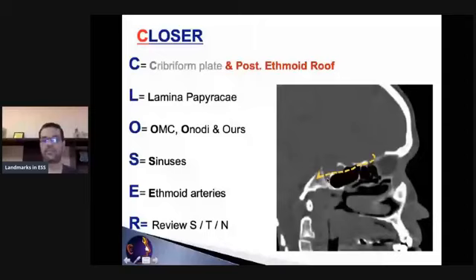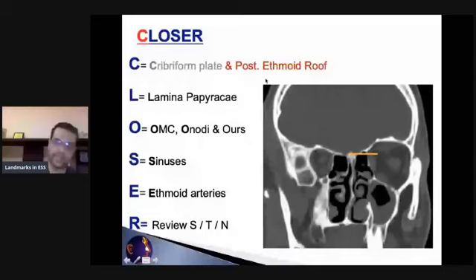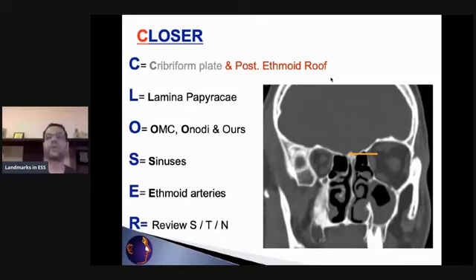So that's an arrangement that's important to remember. Now, the question is, the posterior ethmoid roof, as it goes inferiorly, as we go backwards, how much inferiorly is it going to go? Because this is the second most common area for injury during endoscopic sinus surgery, and you need to understand exactly where it lies in the field. Now, you see, that's the posterior ethmoid roof. We have a very fixed, very helpful landmark, which is called the medial orbital floor, or the MOF. And the question becomes, how far is the posterior ethmoid roof going to be from the medial orbital floor?